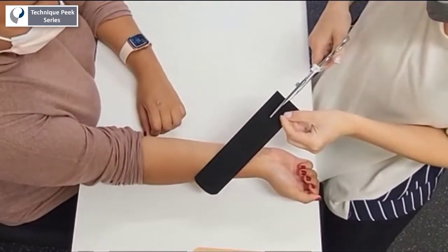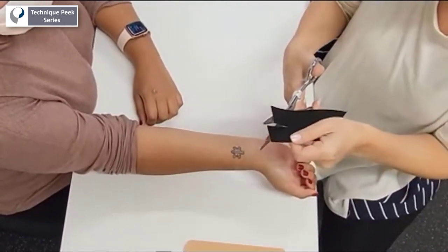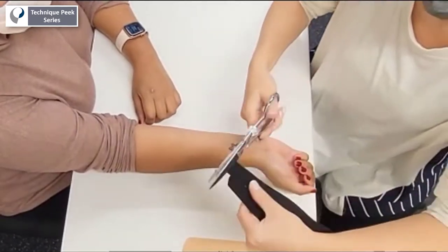Next, you'll want to cut a small slit to make a Y-shaped piece, rounding the edges for better adhesion.